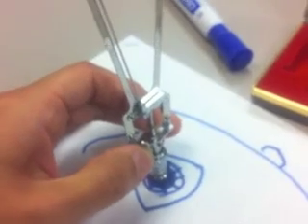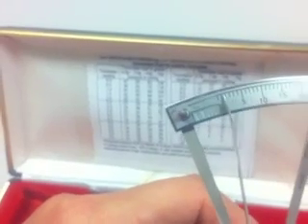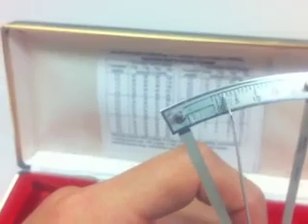What we would do is take our patient, and with their anesthetized eye, gently place the tonometer over the center part of the patient's cornea, holding the sides with the thumb and forefinger. Then we would take a reading. On this patient, we get a reading of 5. Since we were using a 7.5 gram weight, you look on the conversion table for the tonometer weight of 7.5, and that correlates to an intraocular pressure of 26.